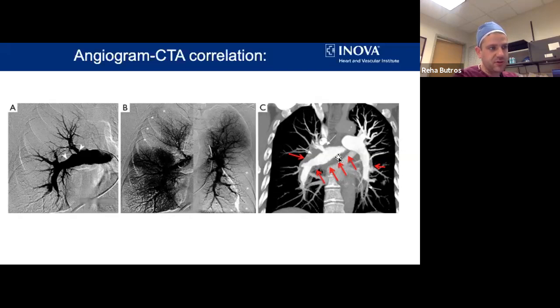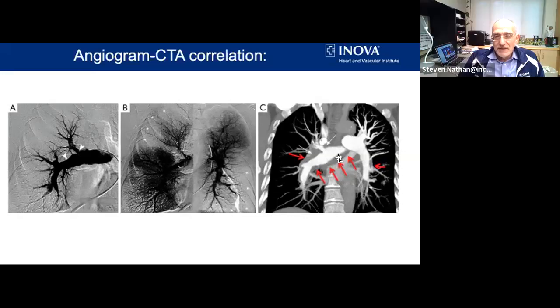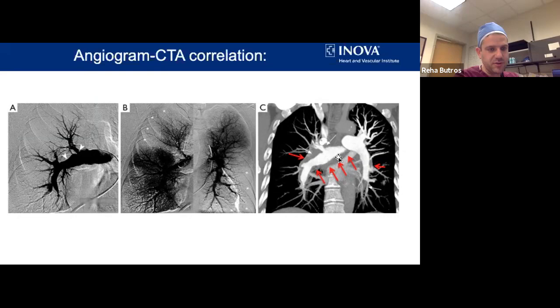I'm not sure if you could do the high resolution CT scan as part of the dual energy CT. Probably, you could do it in the same setting: get the high res first, give contrast, and then do the dual energy after that. That's correct. I guess that's something for us to think about as a group, especially in the patients who we suspect have pulmonary hypertension. It will only take one minute to do the high resolution and then change the settings and give the contrast for the dual energy. It shouldn't be a problem.